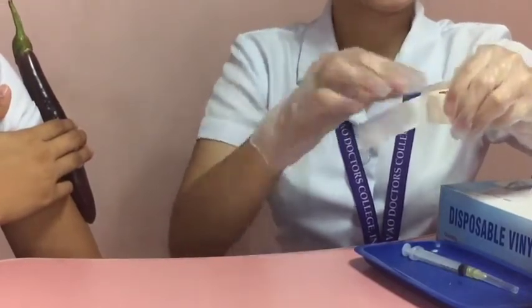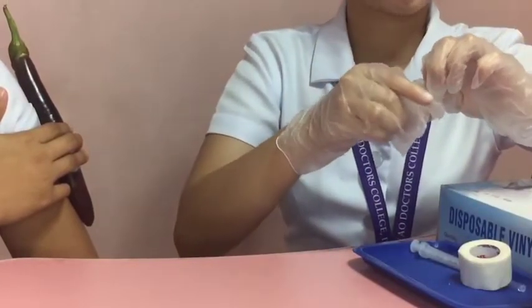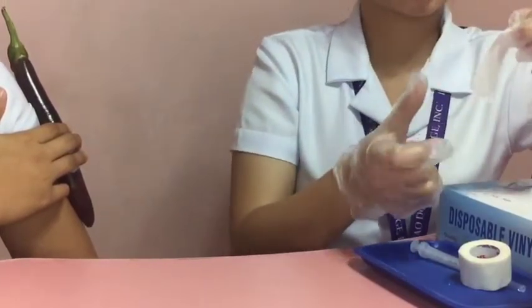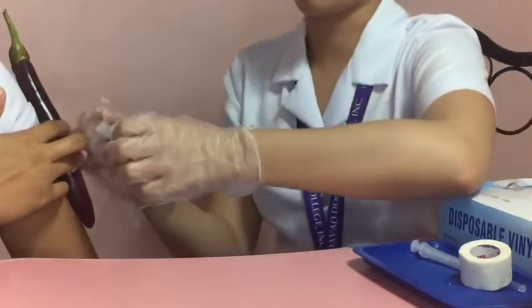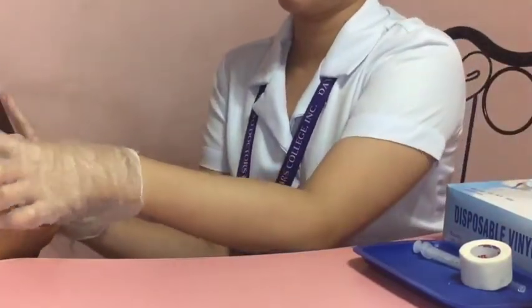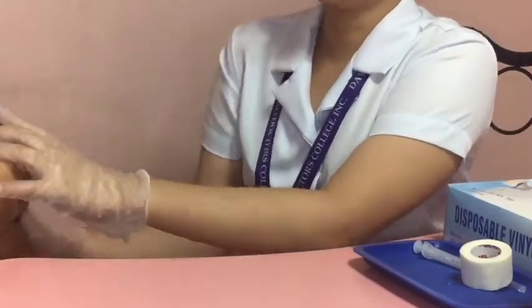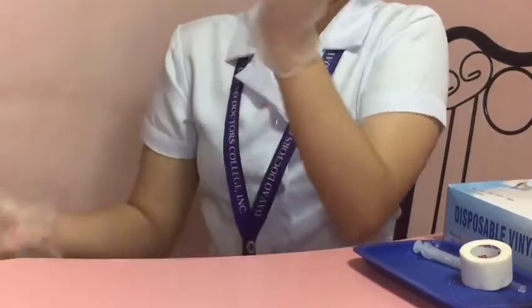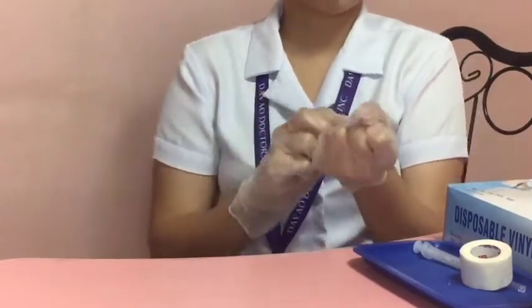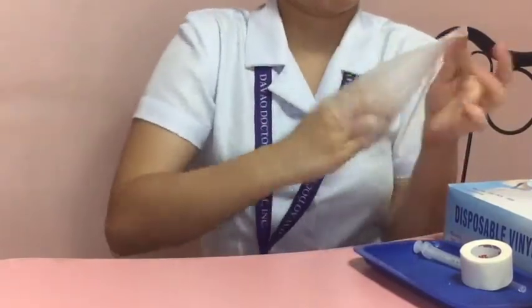After this, activate the needle safety device or discard the uncapped needle and attach the syringe into a proper receptacle. Okay, so we're done, ma'am. So now, let's remove and discard the gloves and of course perform hand hygiene. Then discard the equipment.